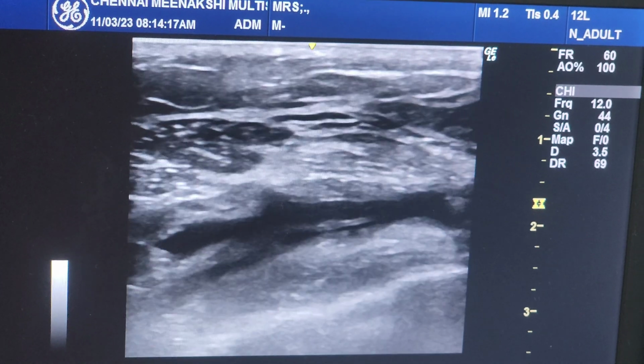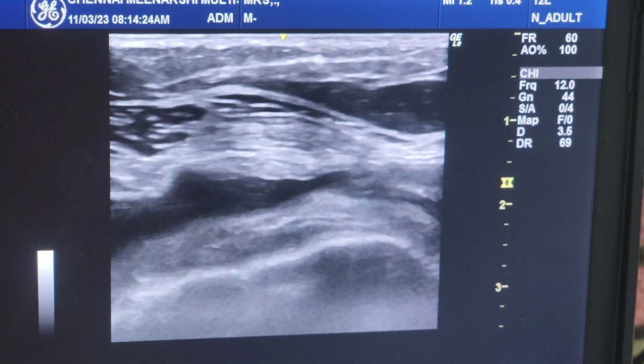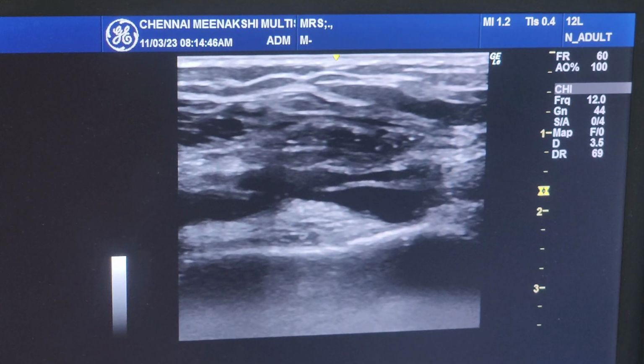That is the area of the effusion, and the needle will come from here, from outside, and it will go into the area of the effusion. So I am injecting local anesthesia into the outside of the leg.